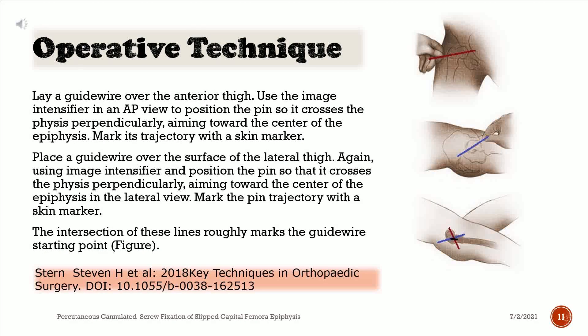Lay a guide wire over the anterior thigh. Use the image intensifier in an AP view to position the pin so it crosses the physis perpendicularly, aiming toward the center of the epiphysis. Mark its trajectory with a skin marker. Place a guide wire over the surface of the lateral thigh. Using an image intensifier, position the pin so that it crosses the physis perpendicularly, aiming toward the center of the epiphysis in the lateral view. Mark the pin trajectory with a skin marker. The intersection of these lines roughly marks the guide wire starting point.